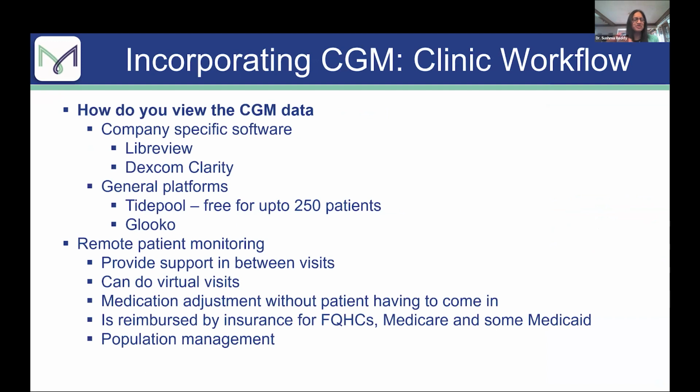And then when you view this data, you need to have a way to view it. You could have the Dexcom Clarity for Dexcom, Libre View for Libre patients, or you could have one platform such as Tidepool or Glooko. Tidepool is free for up to 250 patients, and on Tidepool, you can also view pump data. So those are things to keep in mind that would be helpful.